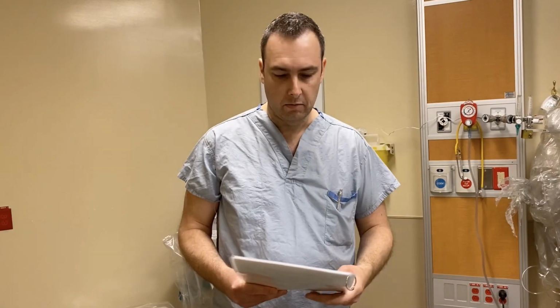All right, so my name is Angus. I'm going to be your team leader today. We need to establish our roles. So I'm going to need 3 people in the room, one being myself as team lead. I'm going to need an airway nurse, and I'm going to need a primary intubator. We need 2 in the ante room, 1 person as a secondary intubator, and another as a second RN that'll be ready to come in the room if needed.